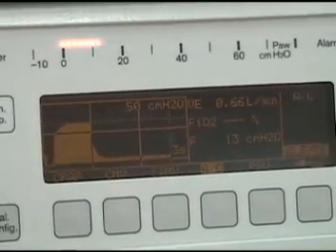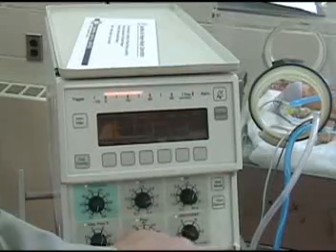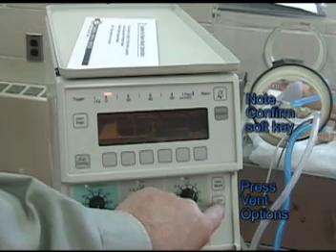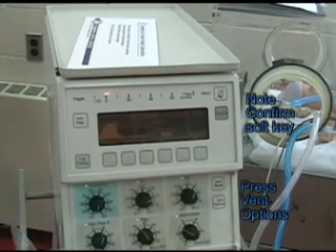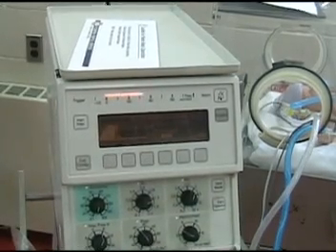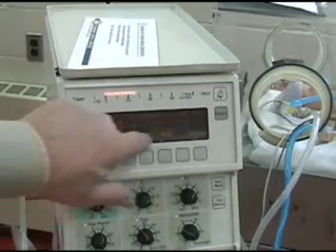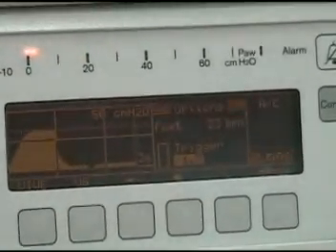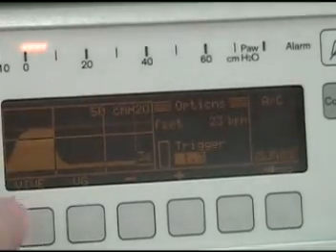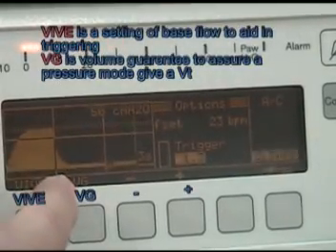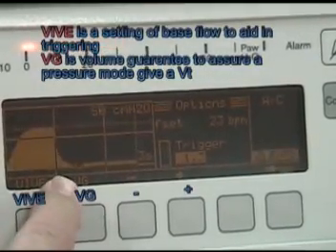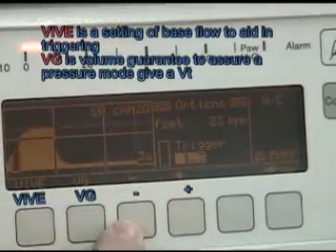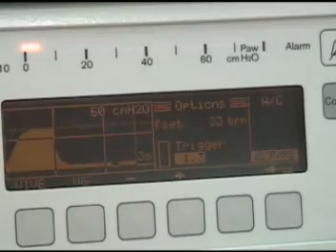Ventilators do have — this ventilator has additional options. Right here if we press ventilator options, the whole information here now changes and we can see that we have VIV, E, and VG, Volume Guarantee. And we can change that using these plus or minus buttons.